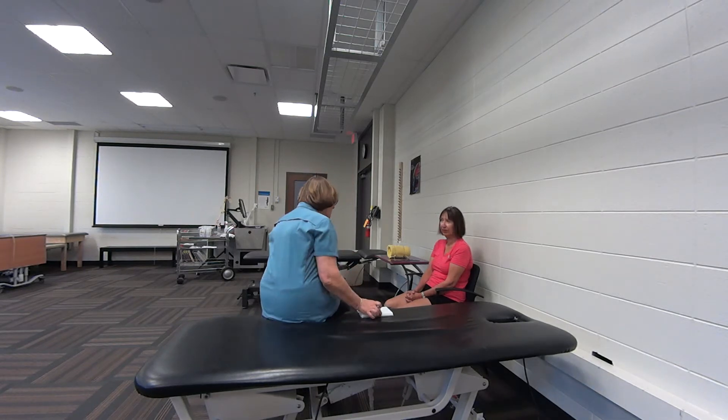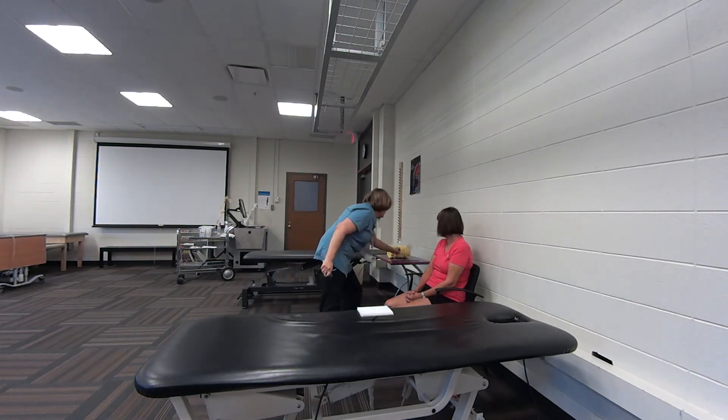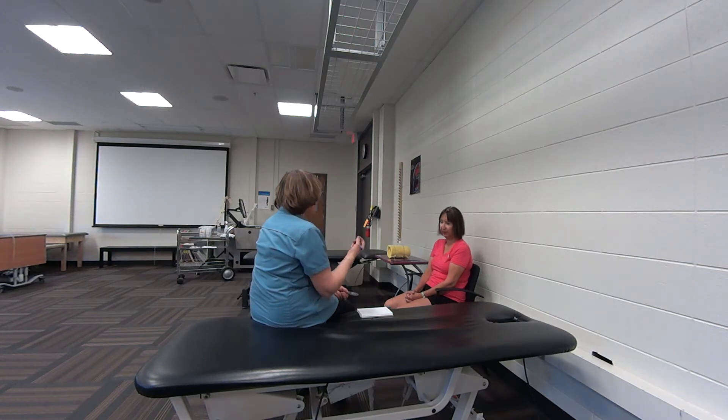So what I'm going to do is I'm going to measure your ankle with the goniometer. You've used those before with your physiotherapist Nancy, right? Right, I've seen that before, yes. So I'm going to measure your ankle first and then I'm going to have you show me the exercises that you've been doing at home. And I'm going to do a stretch on your ankle after that, and then I'll measure your ankle again. I'm going to do all of this before you see the physiotherapist just so everything is ready for her. Do you have any questions about what we're going to be doing together?